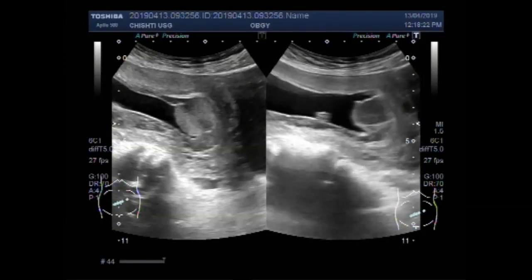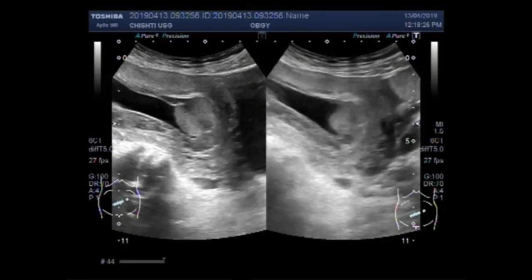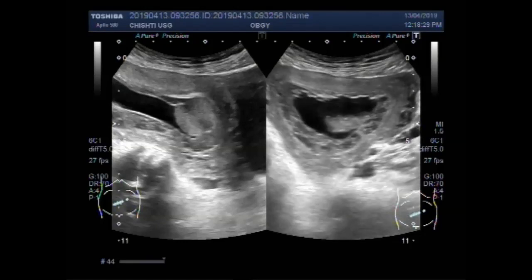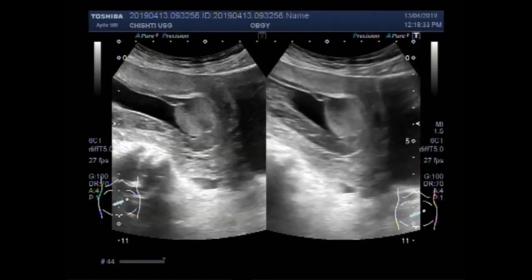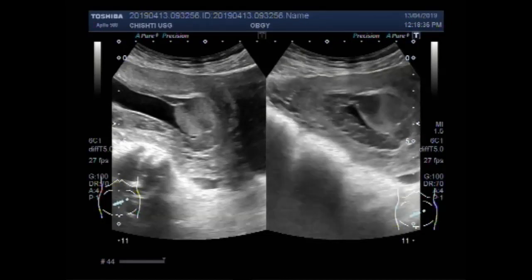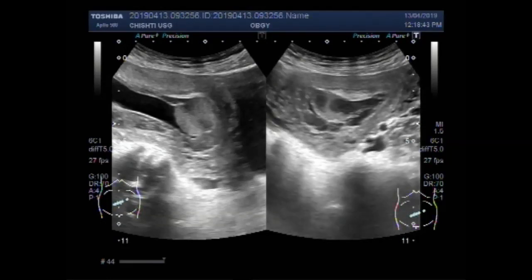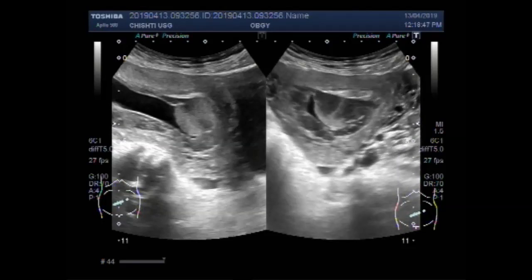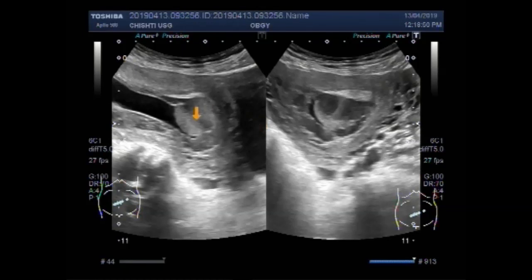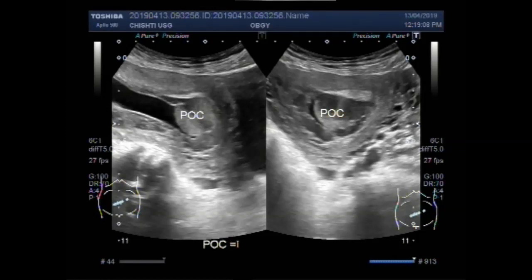Again you can see the polyp — an endometrial polyp seen in the gestation sac. This one looks like a polyp, and I don't think it is a product of conception as labeled here. It looks like an endometrial polyp.